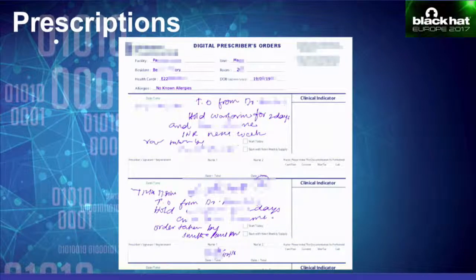But since we went directly to the database and completely bypassed the presentation layer, which is the portal, which might have some segregation, now you're directly on the back end and can pull out all this data. So we were able to view data from all the medical and healthcare institutions where this pen was deployed, not just where our test pen was deployed. That was tons of medical data.